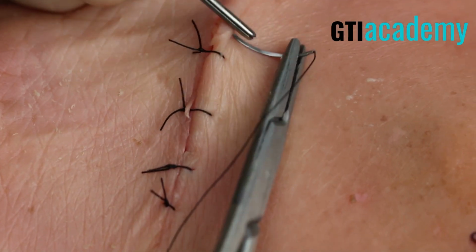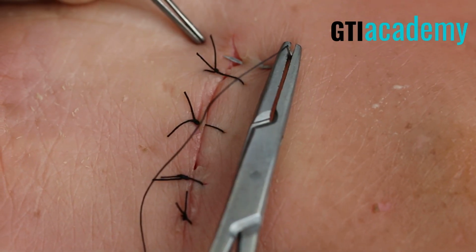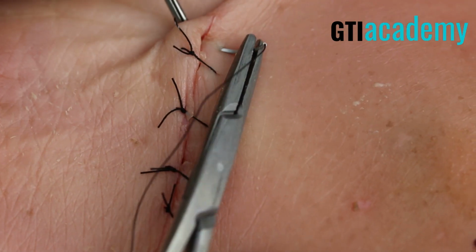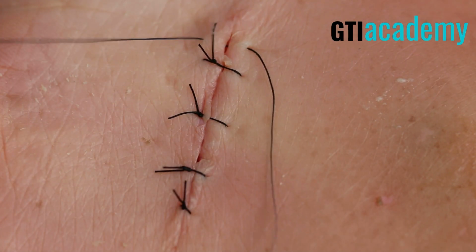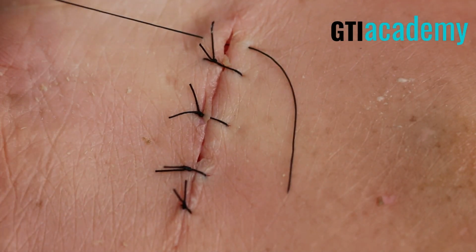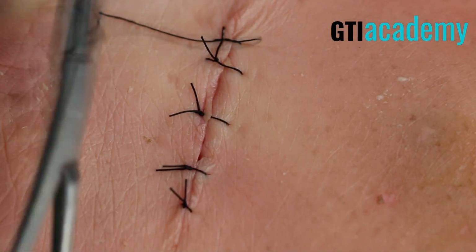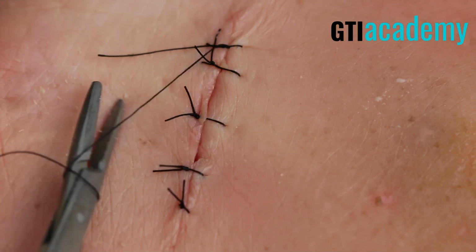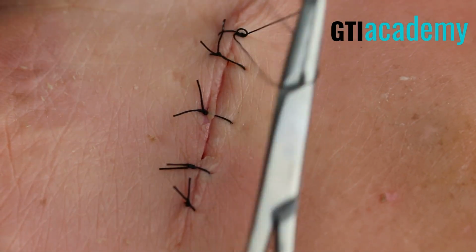So there's the very top. Let's throw one more right here. Notice I'm driving that needle into the subcutaneous tissue. Don't be too superficial. The suture will not hold. Again. Very good.